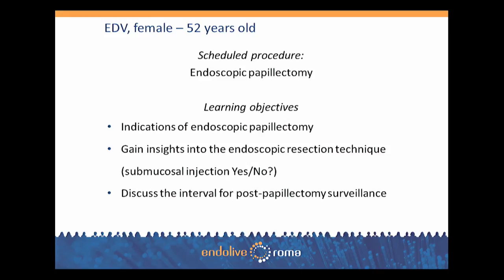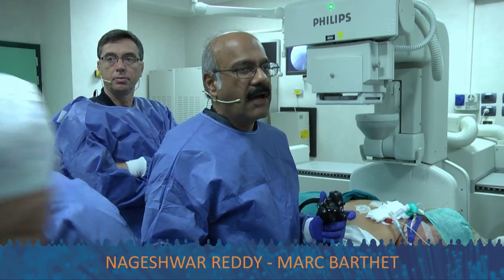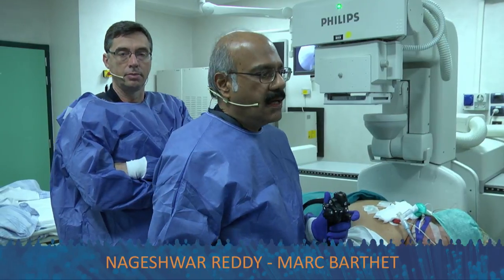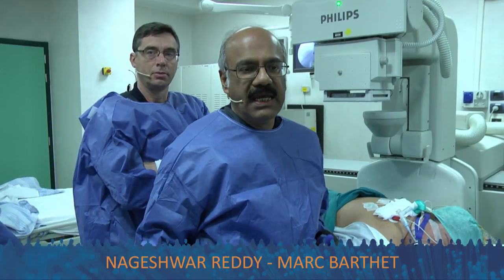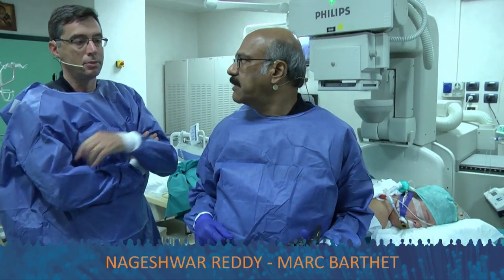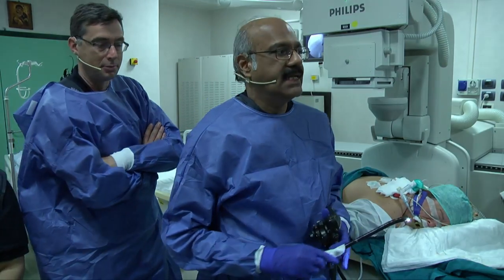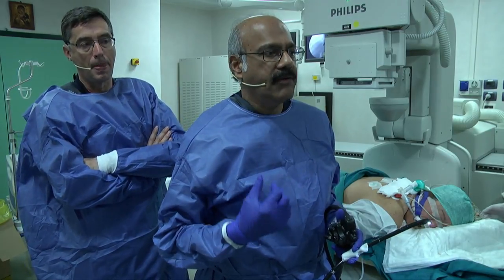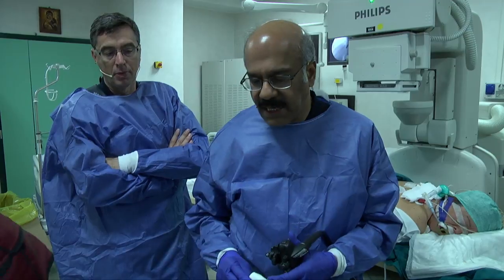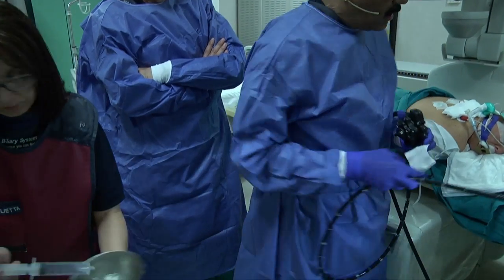We go live to the endoscopic room. This is a very interesting case. I have Mark Barthet supervising me, so hopefully we'll be successful. We have this patient who has a large ampullary tumor situated in the peri-ampullary area. We're not sure whether the papilla is coming from the tumor or whether it's lower down.